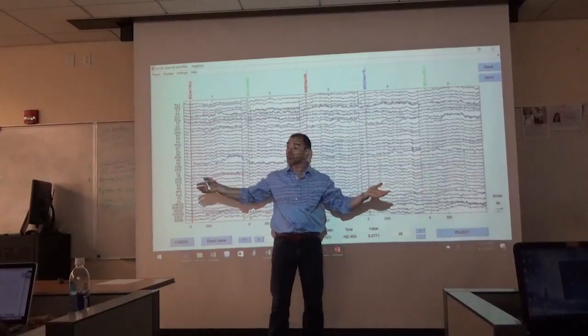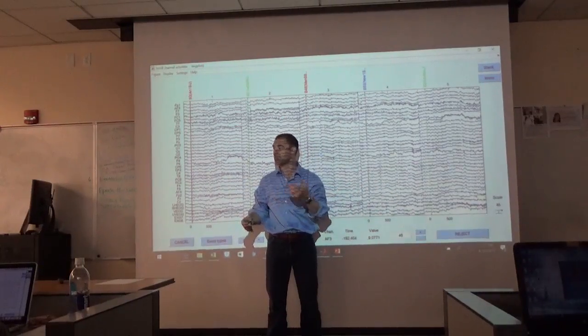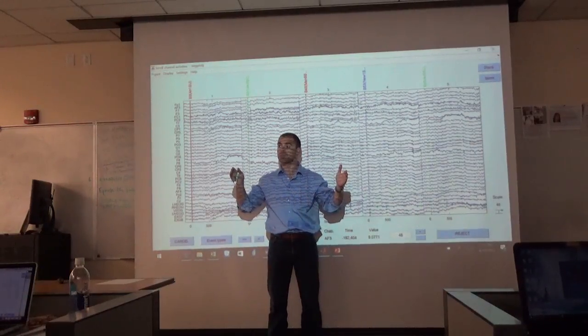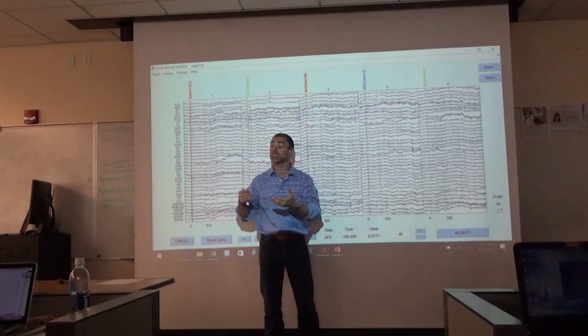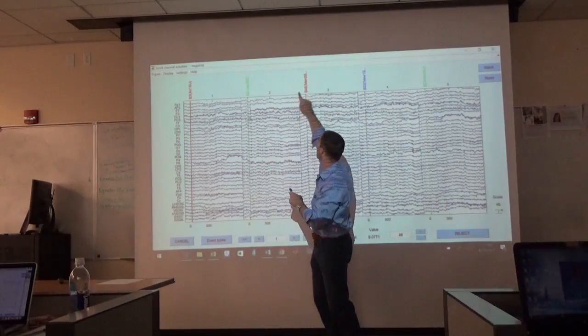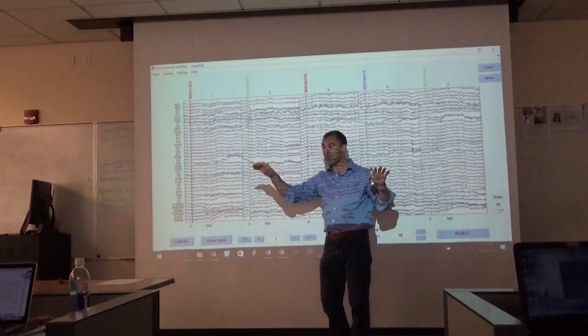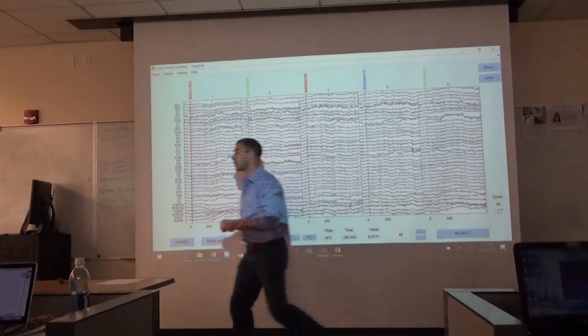Now we cut out all that extra stuff in your experiment when they're saying source memory and stuff like that, because what we care about is what's on the screen when they first see the word. We still know what they did say for the source memory because we have that in our 4-digit code. Does that all make sense? Yeah? Okay.